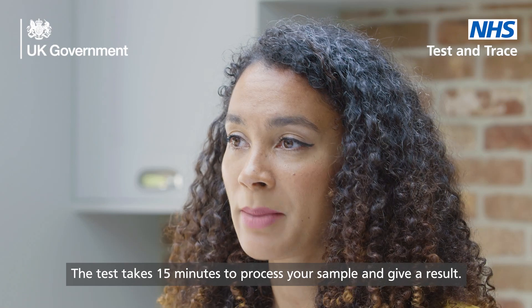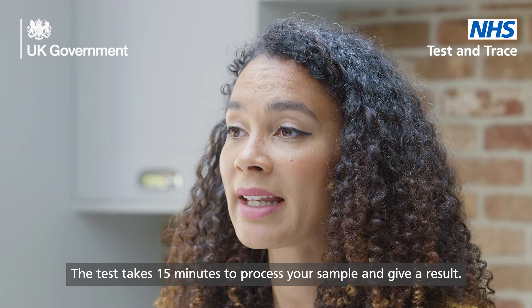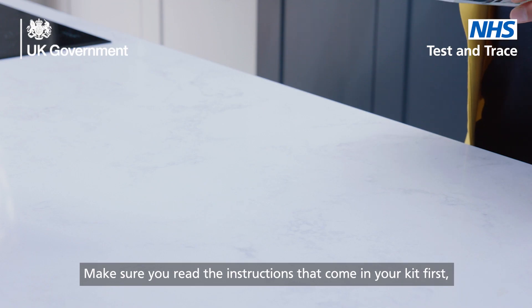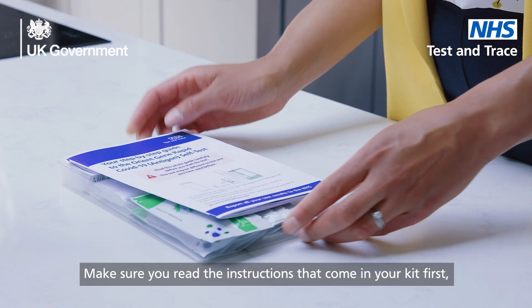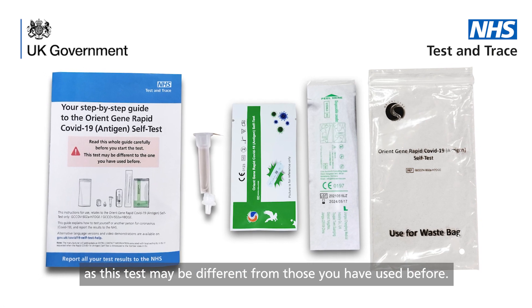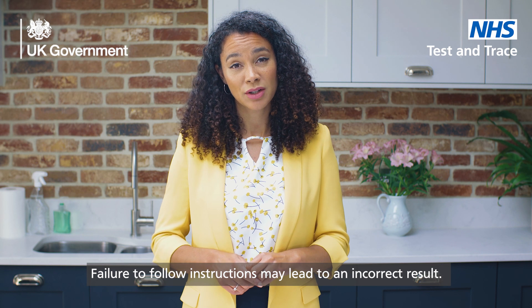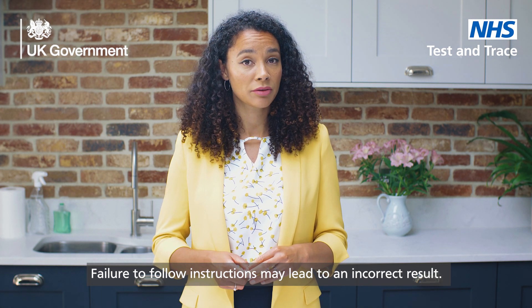The test takes 15 minutes to process your sample and give a result. Make sure you read the instructions that come in your kit first, as this test may be different from those you have used before. Failure to follow instructions may lead to an incorrect result.